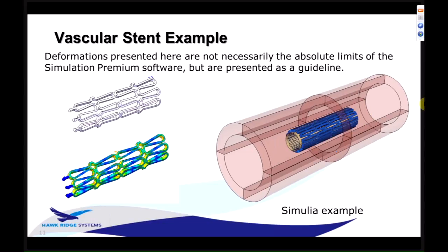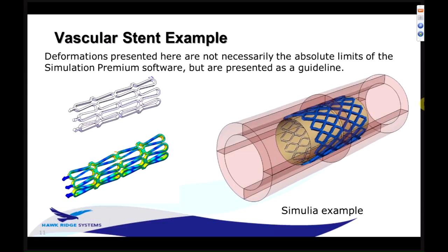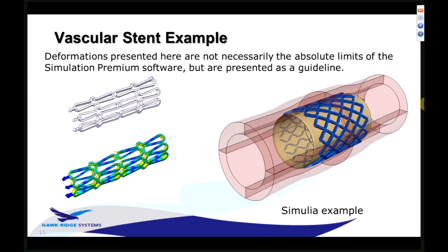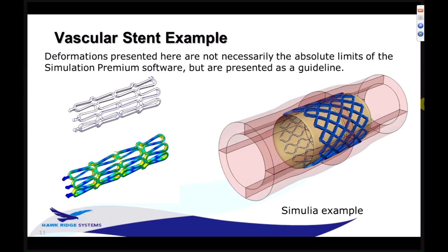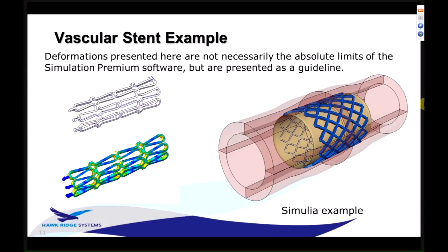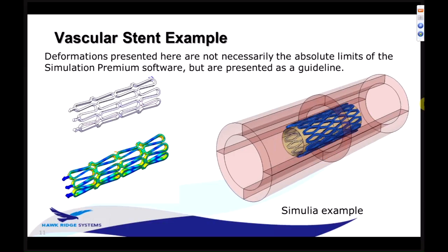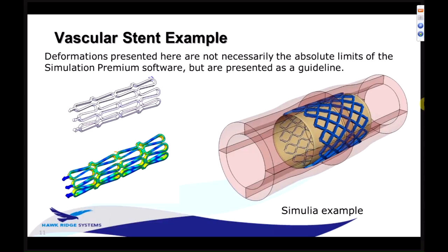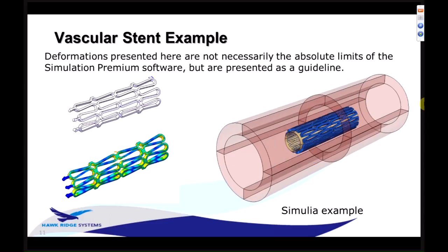And so I wanted to try and illustrate that, but I should point out before I do so that what I'm illustrating here is kind of a sample to give you an idea of the ballpark of the analysis that each software can achieve. It's by no means an absolute limit, and I could do stuff to what I'm about to show you that would allow it to go further, but it should give you an idea of what's possible. So I'm looking here at a portion of a stent.